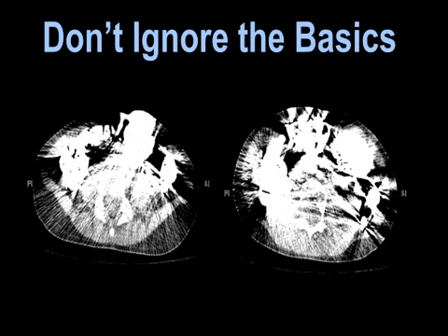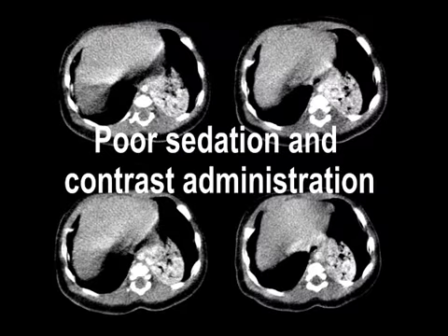The really sad part about this was the report. It said, limited examination, but no evidence of appendicitis. Well, there's no evidence of a pelvis, too. I mean, good heavens. And so, again, these patient preparation issues: this might have been a very low-dose examination, but it was totally wasted because people don't pay attention to patient preparation.